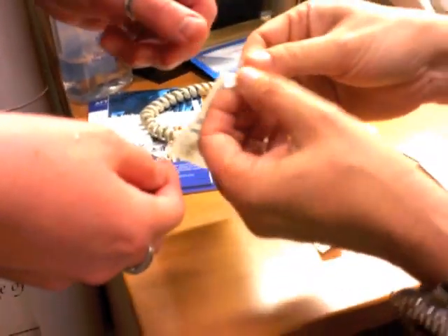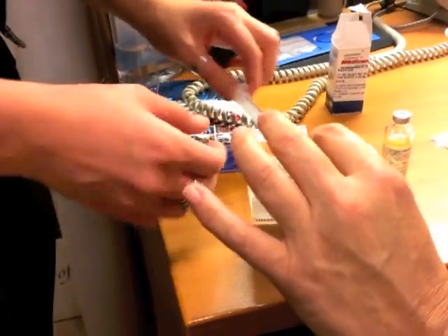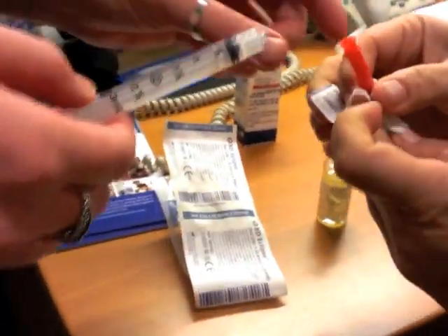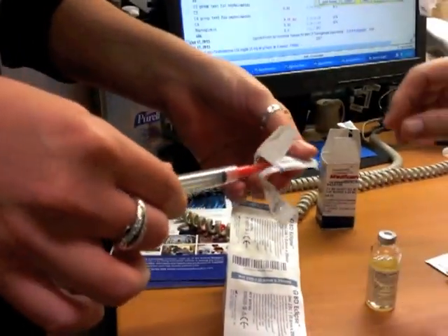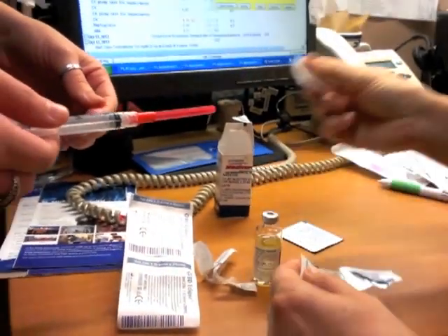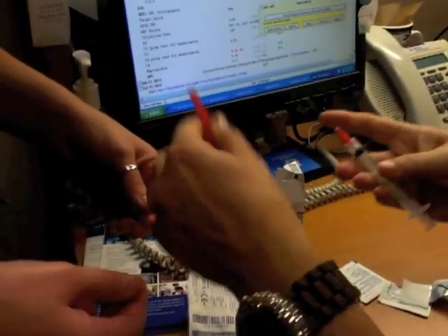Okay, so you're going to open this package, and there's kind of like a lip on one side. You could just pull that apart. So we're just going to leave that open. You're going to take this needle. Yeah. And then we're going to leave that one there because that's the smaller one. And this one will just open up like that. And you're going to screw the needle onto the syringe. Perfect, nice and tight. And then I always give the container a wipe, even though we did take it off a clean top. So we're going to take off the lid. We're just going to drop that in.